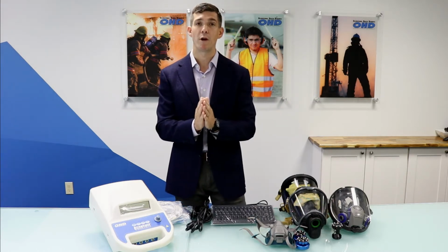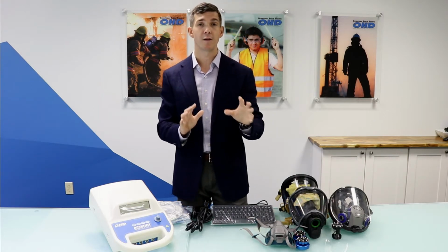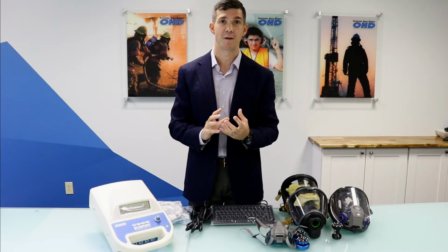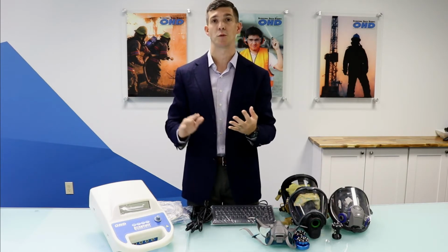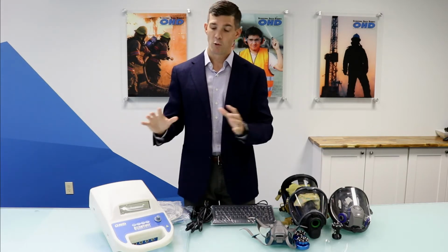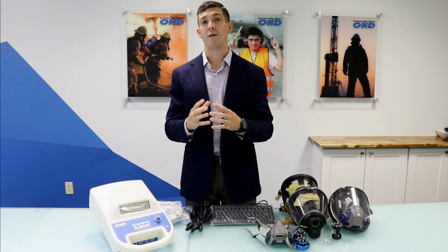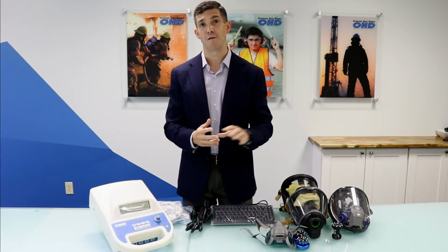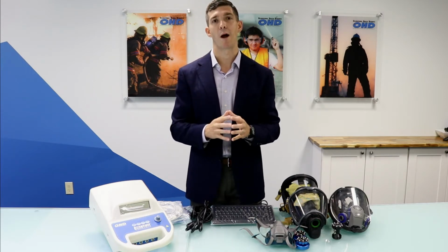But it's very important that I pause here to say that you need to cover all of the test criteria before you start a fit test. Some of those things might be sizing, some of those things are comfort assessments, some of those things are user seal checks. We're not going to cover all of that today. We're really going to focus on our technology for this training, but be aware that there are requirements before you start a fit test that you need to properly do to make sure that you're sizing people properly and that they're well trained to go out into the field.